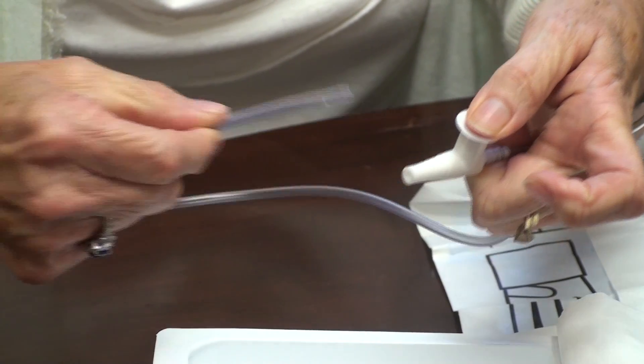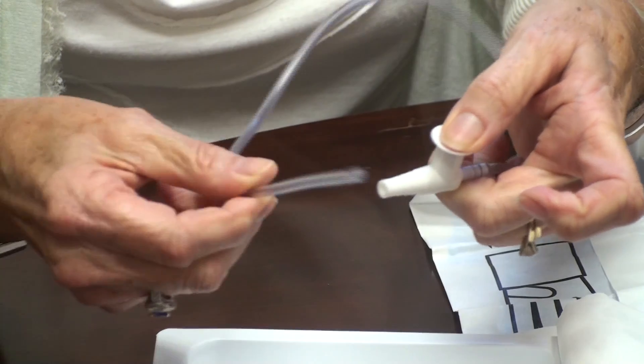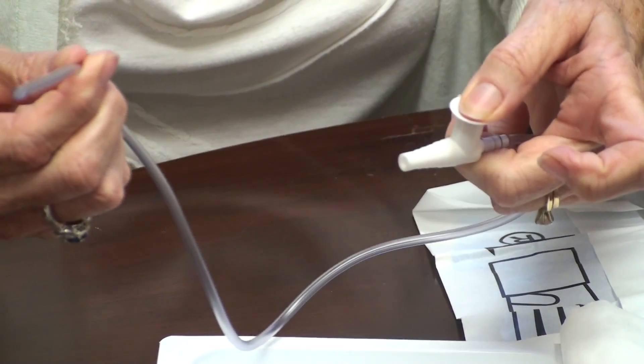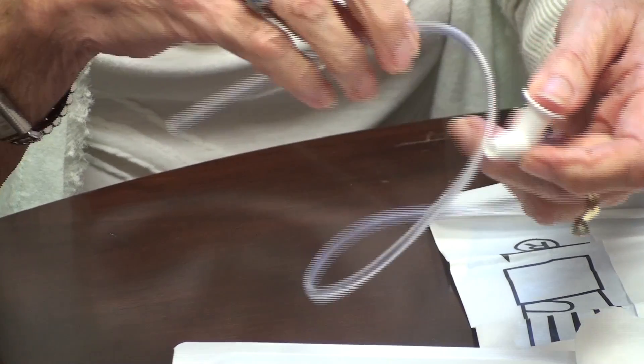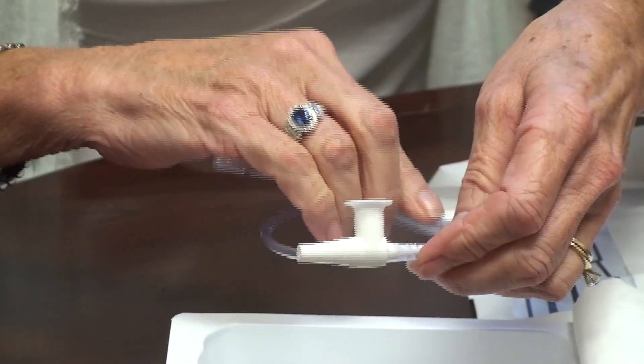And that will make it a closed sealed system so that you will be able to suction the secretions out of the mouth or the nose or the trach, whichever one you are using for skills lab. And that's what this kit looks like.